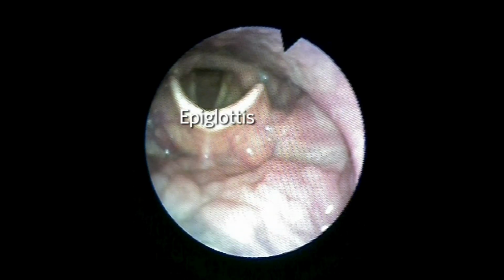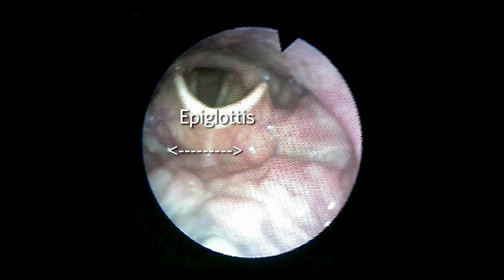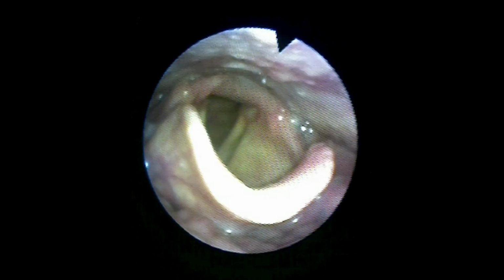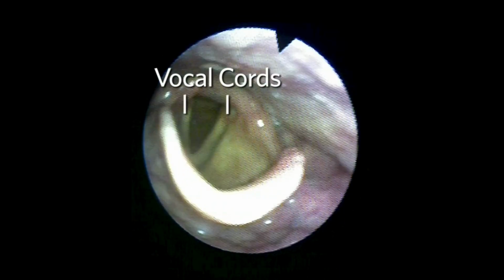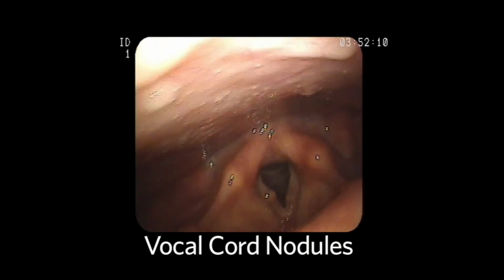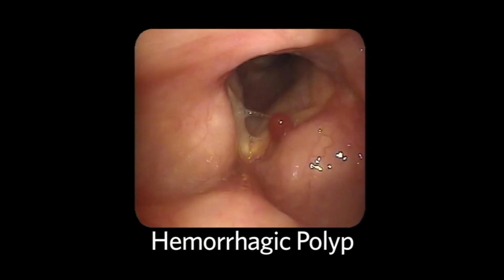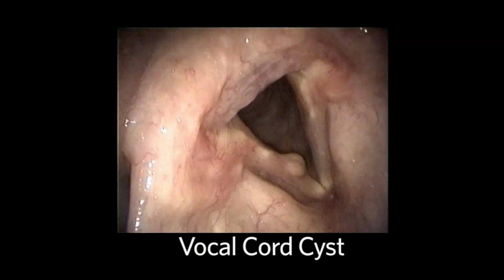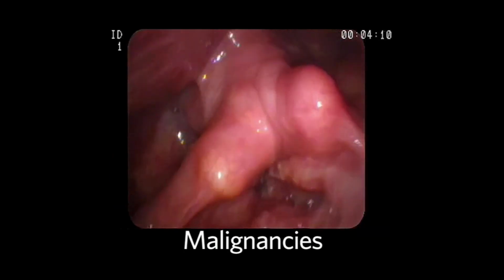The epiglottis is seen posterior to the tongue base. The space between the anterior aspect of the epiglottis and the base of tongue is known as the vallecula. At this point, the larynx and hypopharynx are examined. We typically see smooth, straight vocal cords bilaterally, which are usually white in color. Common pathology that can be seen on the vocal cords include nodules, polyps, cysts, and malignancies.